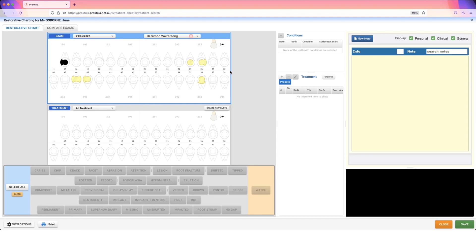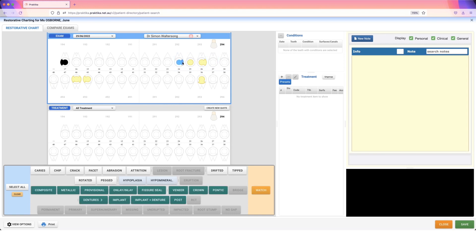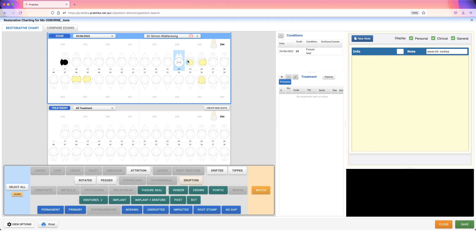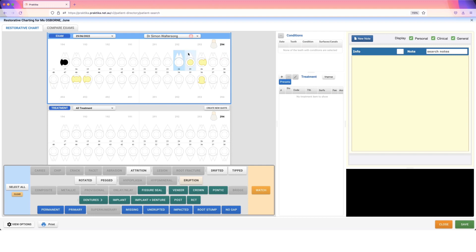All right, so the main thing to remember in your charting is: select the surfaces or the teeth first, and then select the condition that you'll need to pop in place here. So I can say maybe 2-4 has an existing fissure sealant, and that will pop that in place. If you make a mistake, maybe it wasn't the 2-4 that you were supposed to select, it was the 2-7 instead. All I'd need to do is highlight that tooth and you will see over here in our conditions that 2-4 fissure sealant. We click the minus and then it's gone. So if you have to make any changes, you can select teeth, you can select multiples at a time.